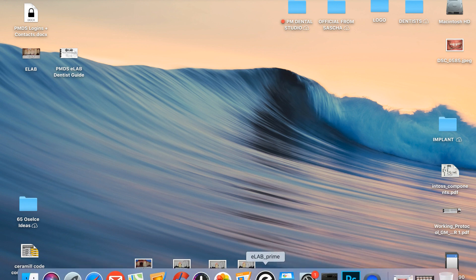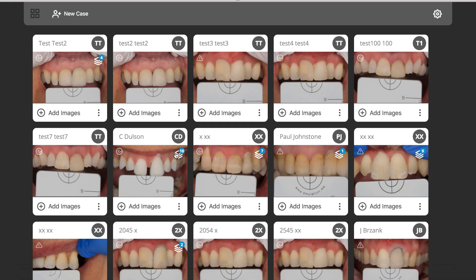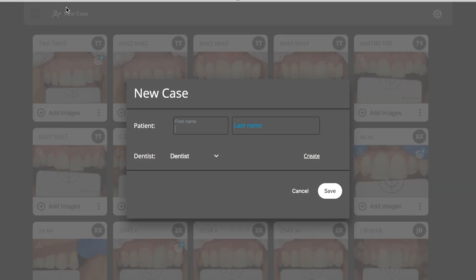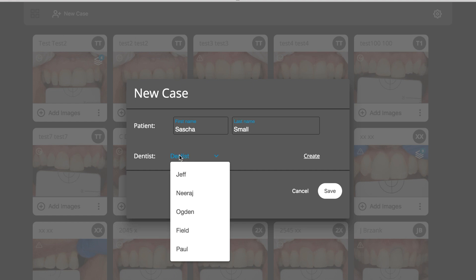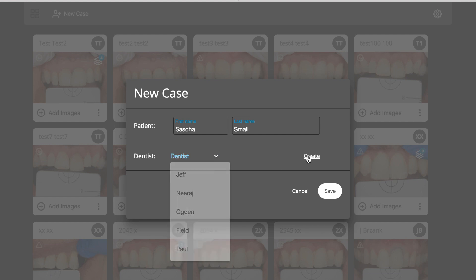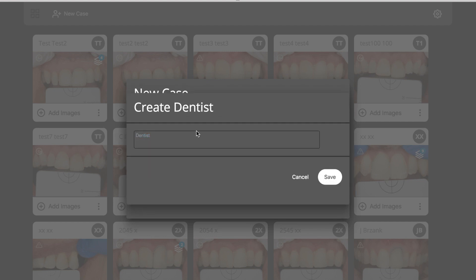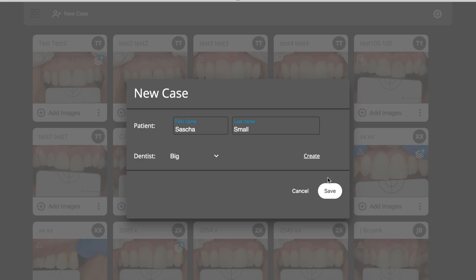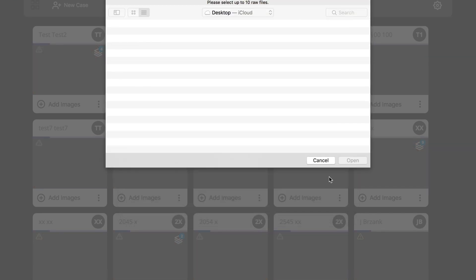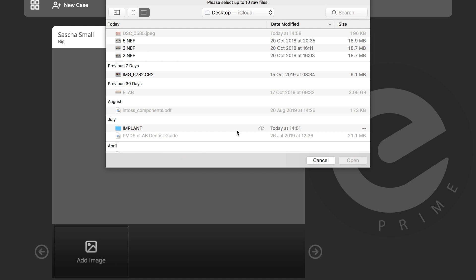This is my screen. I will open eLAB Prime and this is how it looks — very easy. New case, patient name: I'll say for example 'Sasha Small' — don't take it personally, Sasha. Here I have dentists, so you can either choose one of your dentists or create a new one.